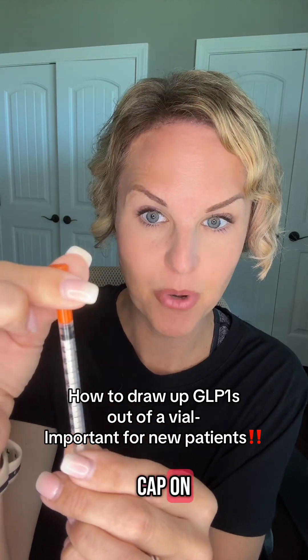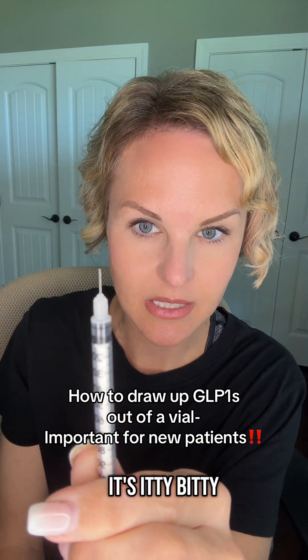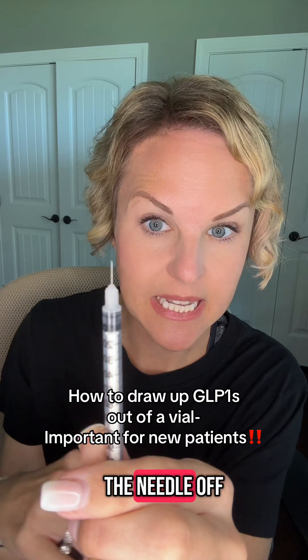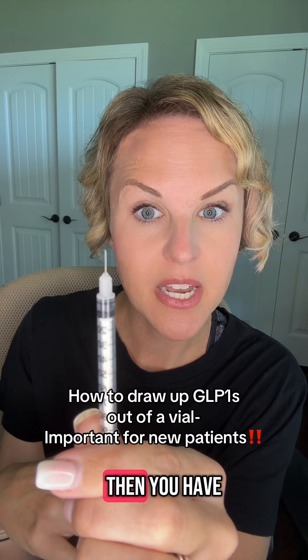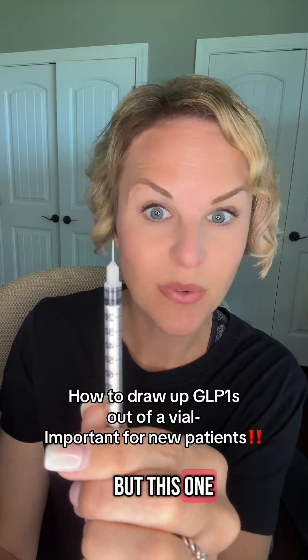What you're not seeing because the cap is still on is a little tiny baby needle — it's so tiny, itty bitty. This is an insulin needle, and this needle is not interchangeable; you can't take the needle off and on. So if you accidentally bend this needle, you have to start over with a new one. Some syringes have a needle that comes on and off, but this one does not.